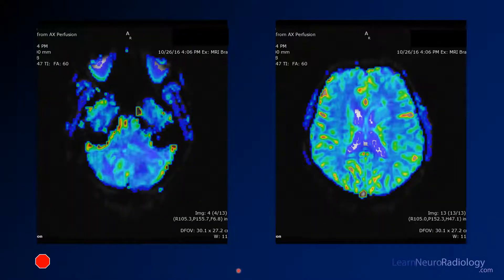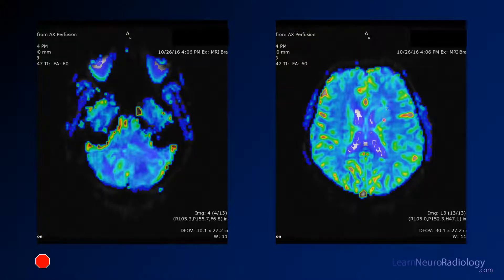On perfusion, there are definitely areas of hyperperfusion related to this tumor, with some areas of central hypoperfusion in the left basal ganglia, though that area is hyperperfused relative to the adjacent white matter.